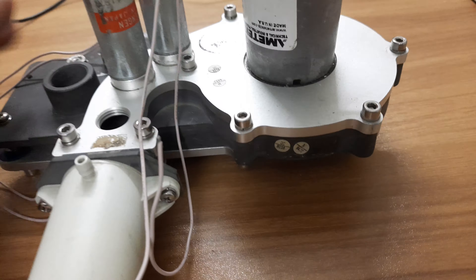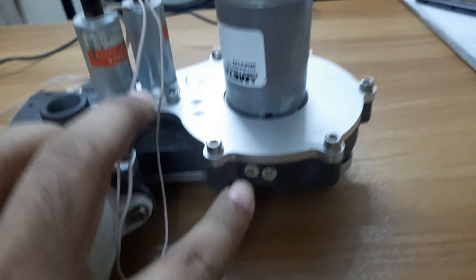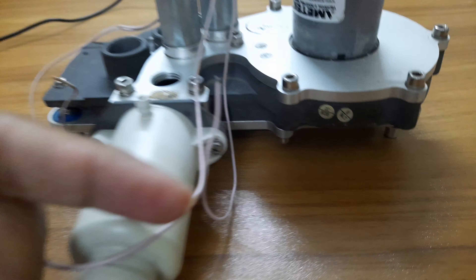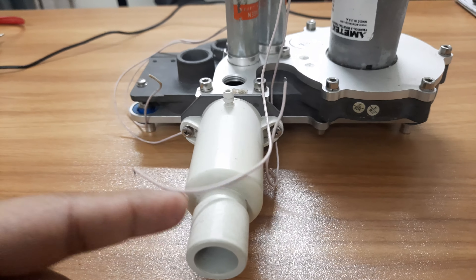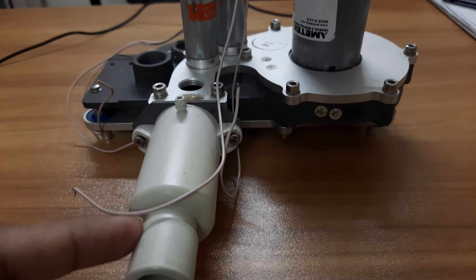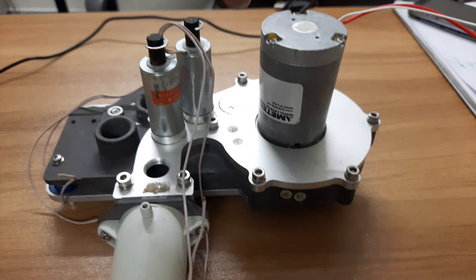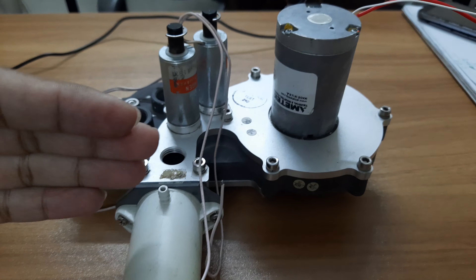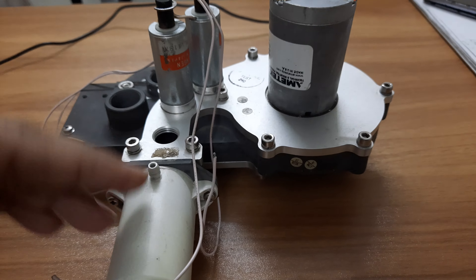Beneath this motor there is actually a turbine — a propeller — which compresses the air. This is the outlet; this outlet actually connects to the inhalation port of the ventilator. The ventilator varies the motor speed so that you can increase the pressure generated from the turbine.